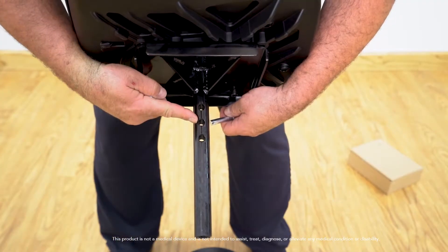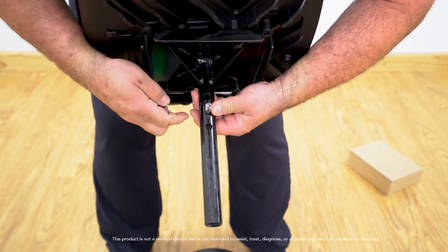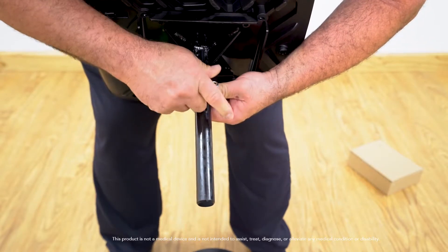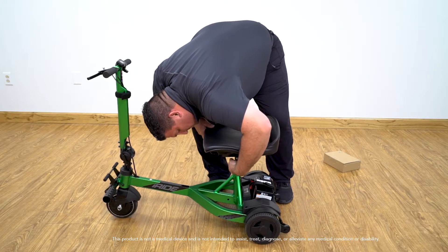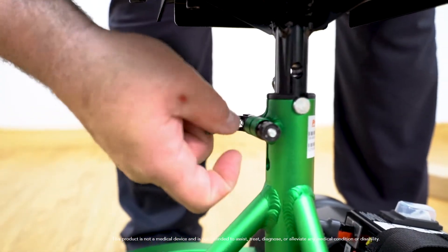You can adjust the seat by removing the pin and inserting it into the desired height. Attach the seat, and after you attach it, lock it into place.